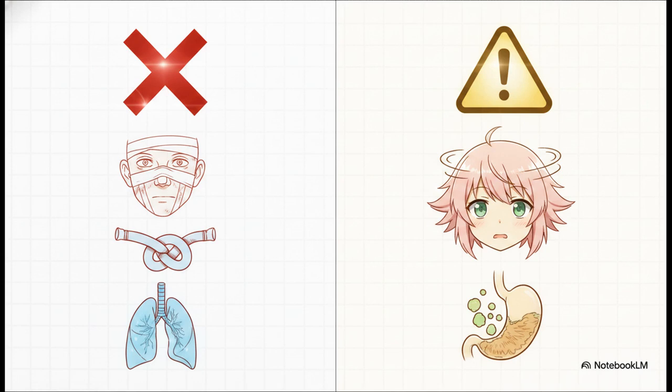But applying positive pressure blindly can be incredibly dangerous. We have to run through the contraindications. Absolute contraindications are non-negotiable: facial burns, fixed upper airway obstructions, and, most critically, an undrained pneumothorax. Trust me, you absolutely do not want to turn a simple pneumo into a lethal tension pneumothorax.